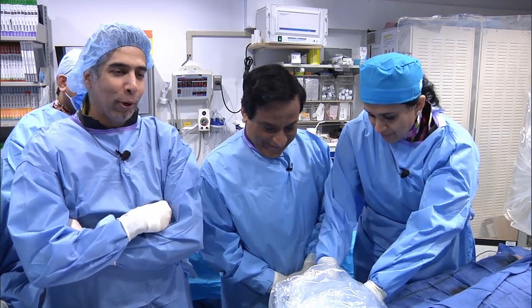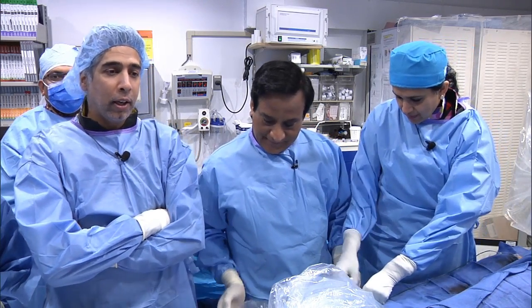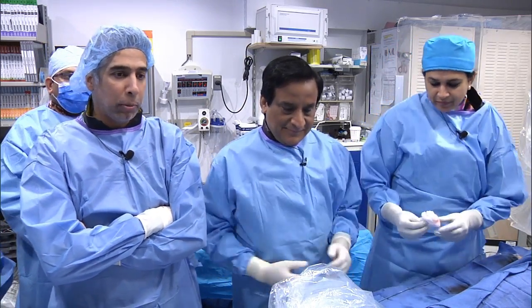I would just add one more thing, actually, that there are a lot of people that do advocate for starting with the left radial initially. It's certainly a little bit easier. There's less fluoroscopy time. The catheters behave a lot more like transfemoral catheters, and that adds to the fact that when transitioning to radial procedures, it's important to incorporate the entire team, the techs, the nurses, in terms of setup, different equipment, and things like that.